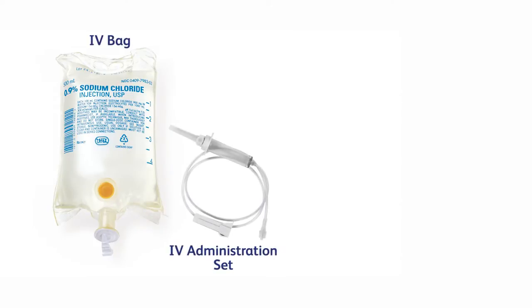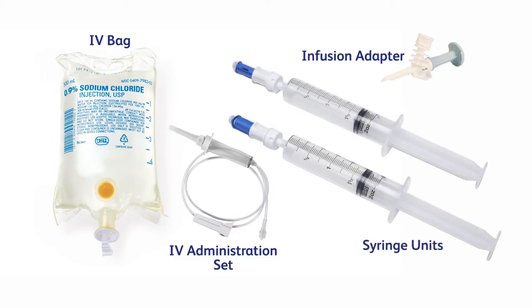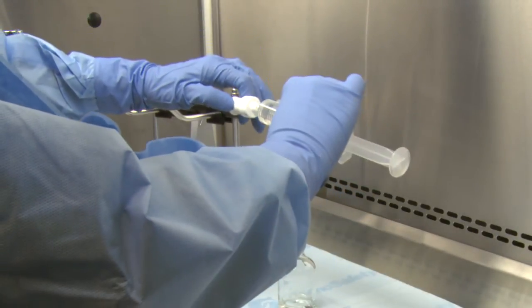To prepare an IV bag using the BD-facil infusion adapter, you'll need an IV bag and administration set, if priming the line in pharmacy, plus a BD-facil infusion adapter, and one or more prepared BD-facil syringe units. For reference, please see the module on preparing a syringe unit.